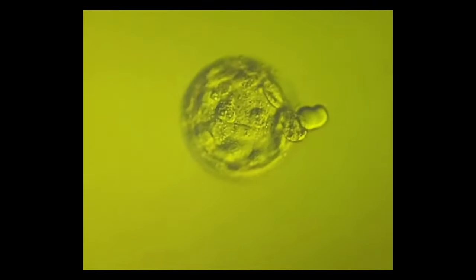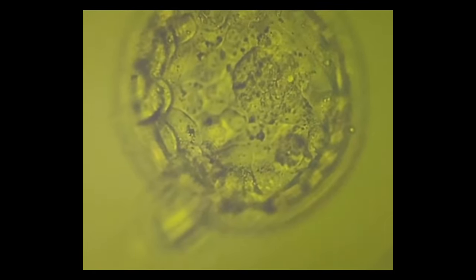So I will take you to another one. We have good, excellent and bad. What are we talking about? The blastocyst and the implantable blastocyst. This is a textbook 5AA again.